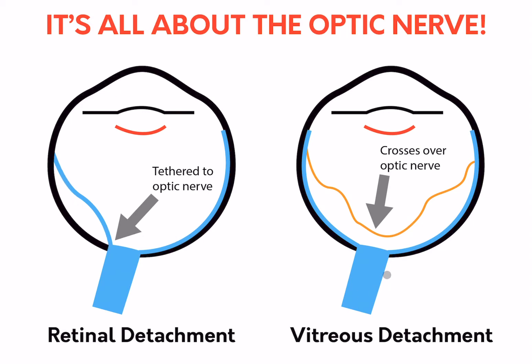As opposed to a vitreous detachment — when the vitreous detaches it can lie over the optic nerve and cross over it. It also is much thinner and has less echogenicity.